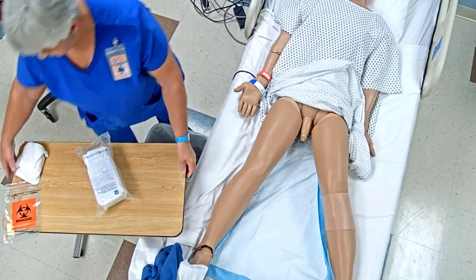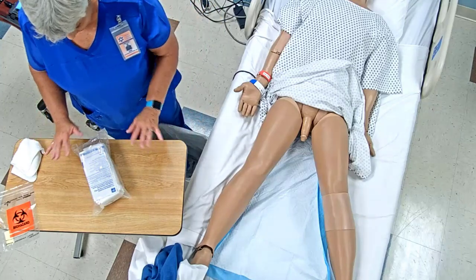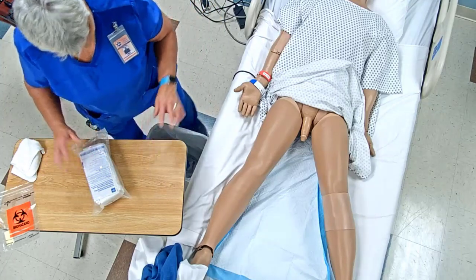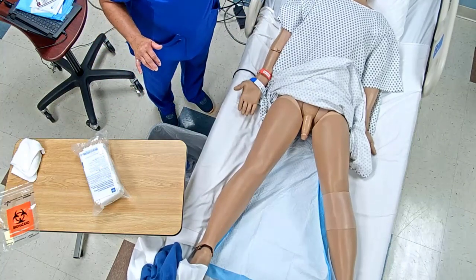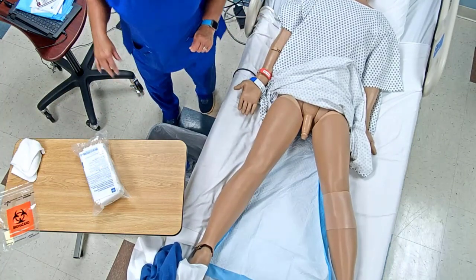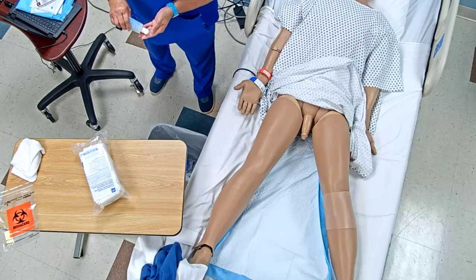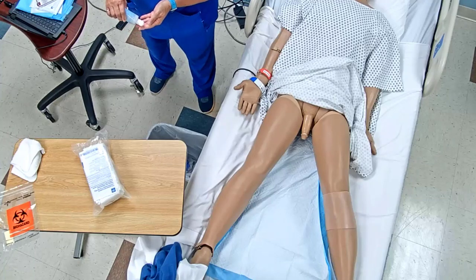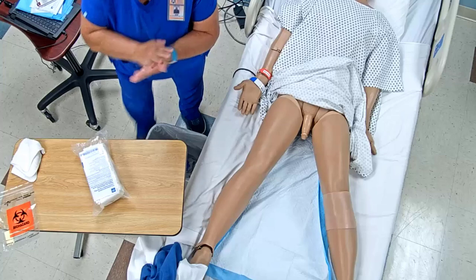Alright, so I want to make sure my tray is at waist level or a good working height so that I'm not going to be dropping my hands. I'm going to get that bed up just a little bit more. That's because I was touching a bunch of stuff. Go ahead and get my hands washed again.